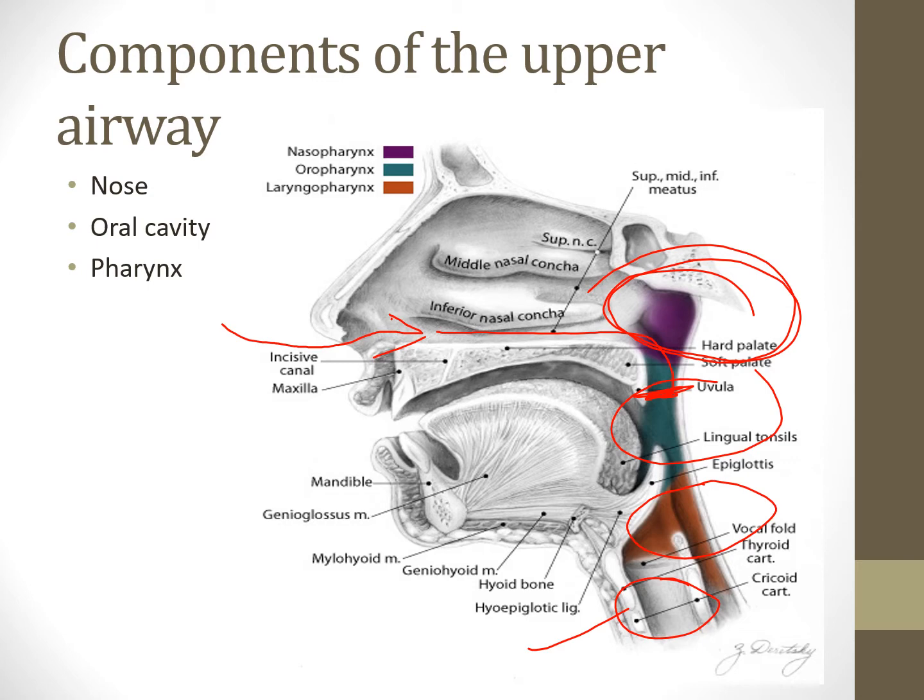So even in conscious sedations, where we're putting someone's shoulder back in place or anything like that, where we put them under deep sedation, their tongue can still flop to the back of their airway. And in fact, almost every case I was involved in with conscious sedations, there would be some level where the patient would be ultra relaxed and they would start snoring, so to speak, and their end tidal CO2 would start to go down because they're not ventilating as well. So I would just do a jaw thrust for those patients. And that jaw thrust, most of the time, was just enough to bring that tongue up off the posterior section of the oral pharynx to allow for them to ventilate appropriately.